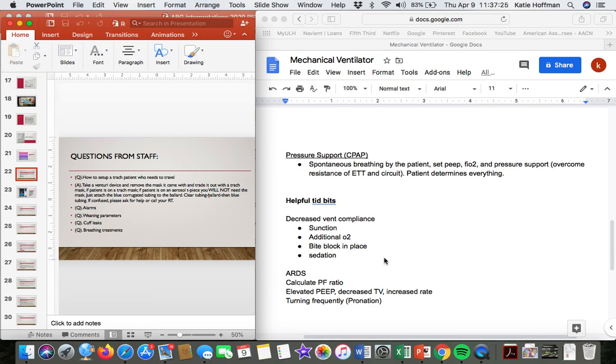There are different alarms. There's a low level, medium level, and high level alarm. Obviously, if your patient is high level alarming, you need to go into the room just to see what's going on. If they're high level alarming, a few different things could be happening. From a nursing perspective, as far as troubleshooting, the first thing I do is make sure my ventilator is connected. Sometimes the ventilator circuit can break, or if the patient is trached, they can pop themselves off the ventilator, which would create a high level alarm, just telling us the patient's not getting the volumes and the mode of ventilation delivered that they're supposed to be.